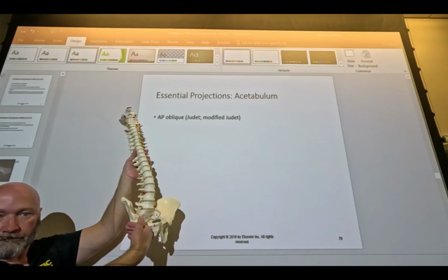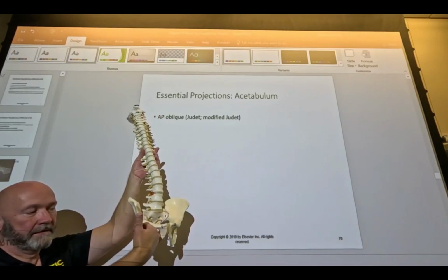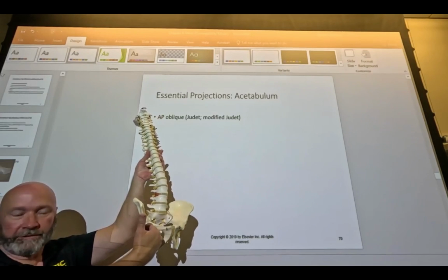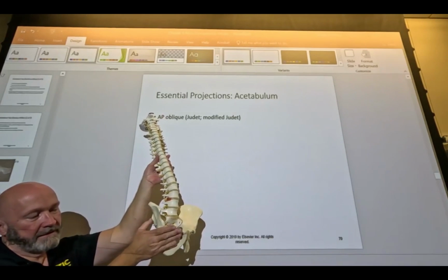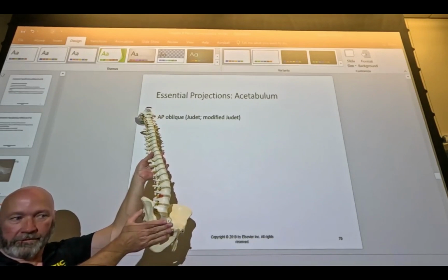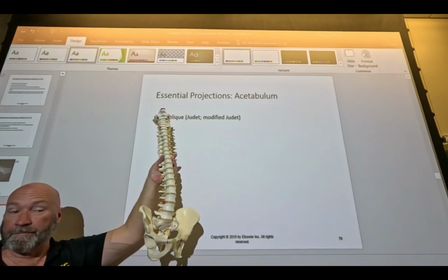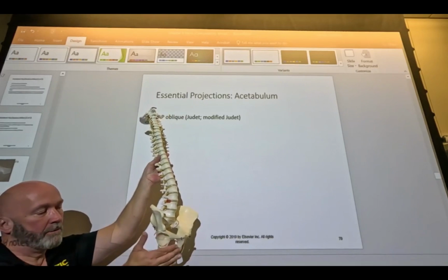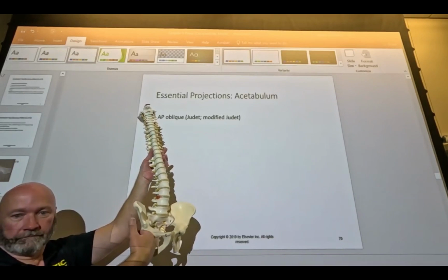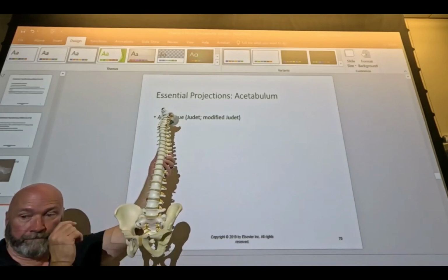So with the LPO, we see the open, elevated right acetabulum. But if you look at image B on page 400, in the RPO, that same acetabulum, we're looking at the right acetabulum in both of those, we get a lateral view of it. So we see an open acetabulum on the elevated side, kind of a frontal view, kind of an AP type thing, and on the other oblique, in this case the RPO, we see a lateral.